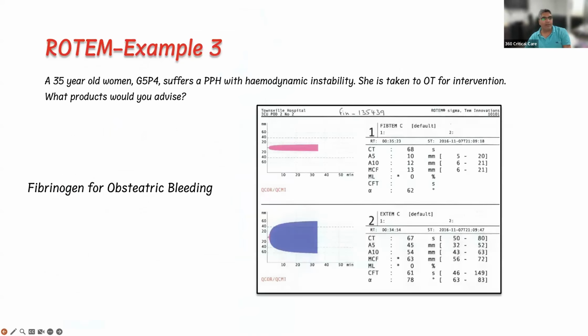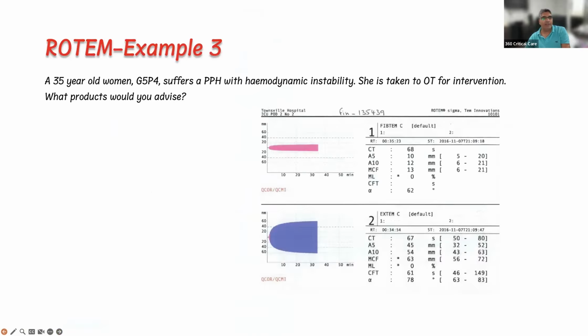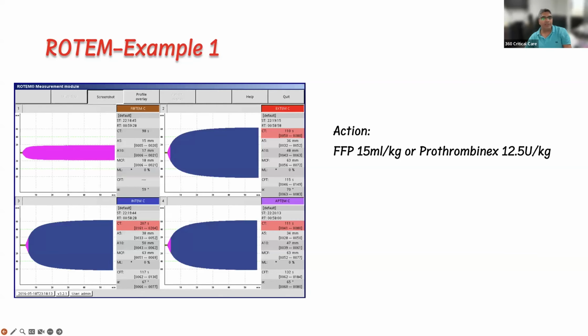Then this one, the first one here, again a straight line: same fibrin deficiency or early fibrinolysis. This one again, you have a narrow FibTem, so that means there is fibrin deficiency. So you need to know what channel you need to see and what the abnormalities are. Just Google some pictures, you'll be well acquainted with that. Sometimes you may not find the numbers.